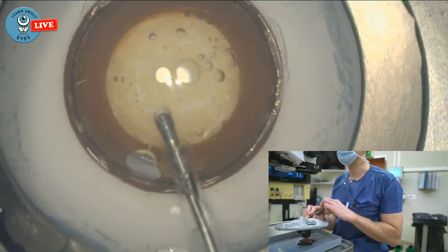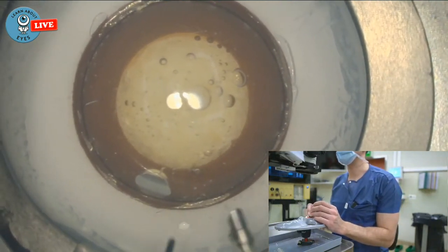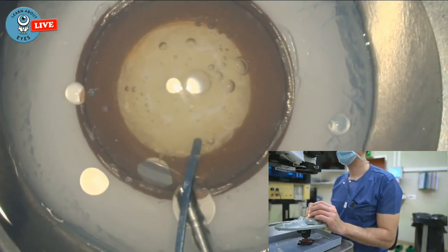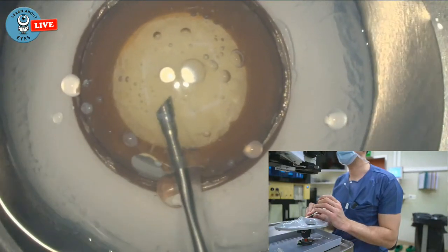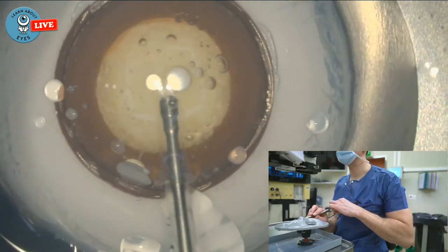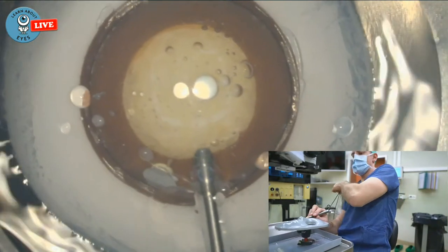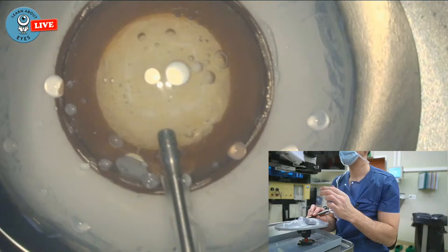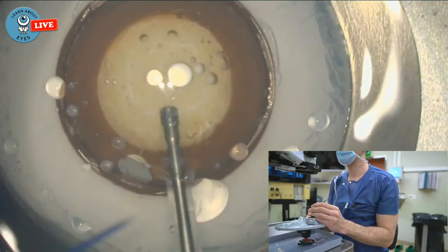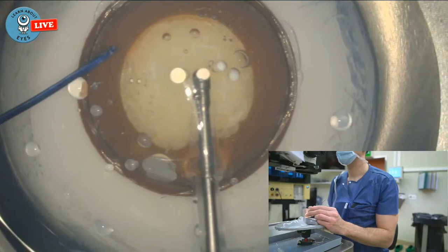This would not be happening in a real eye. That's just because of the silicone. And then of course, once you're in, you do want to turn on that irrigation. Okay, so now you can probably see another issue here. We do have some air bubbles and they do happen quite a lot. Let me just put this over my shoulders here. Usually don't operate from this side. We usually get our things from the left side. Okay, so these almost never go away. They're very hard to suck away.